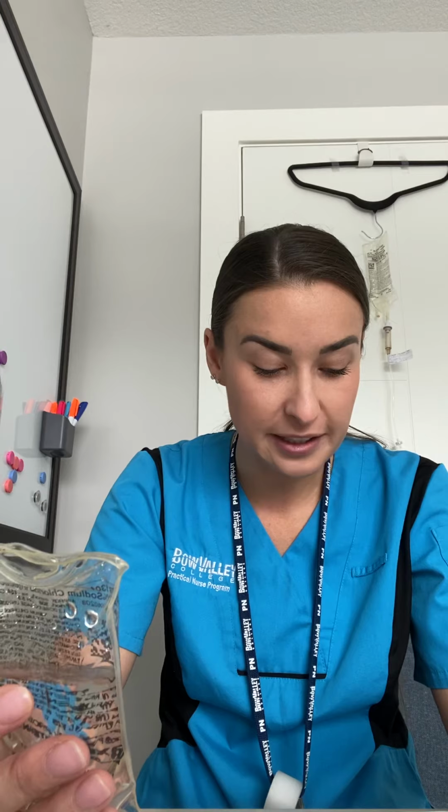It is a 50 milliliter bag. We are giving it through IV piggyback, which is safe, and the expiry is November 20th. So that's safe to give. And our third check: we have 0.9% sodium chloride injection, which is what we're going to use for an IV piggyback. We have 50 mils, which is safe to use here. And the expiry date here is November 20th. So we're safe to use this. Now that we've done 3 checks on that, we can put a drug monograph just over here.